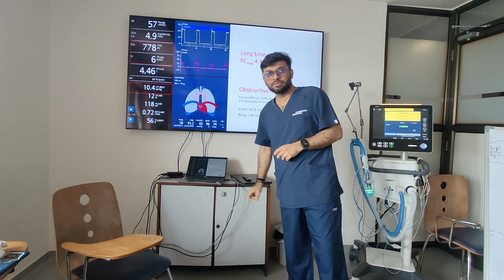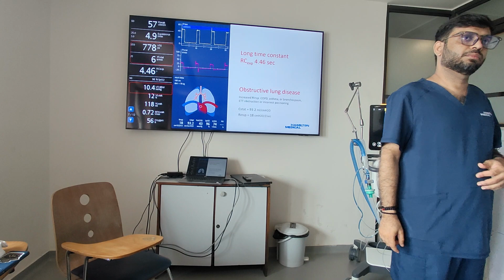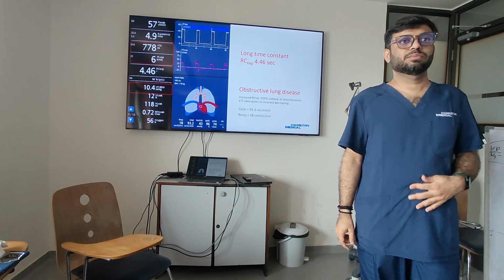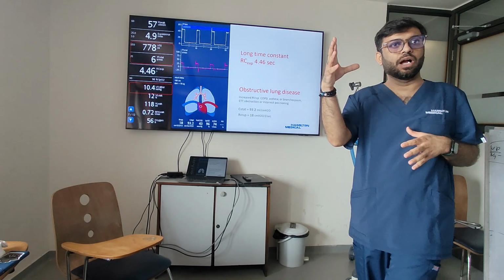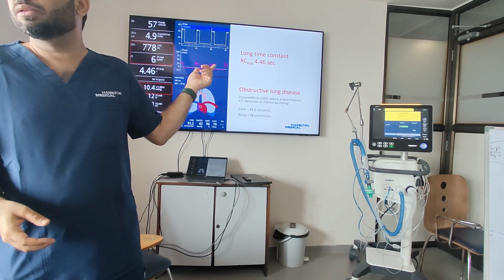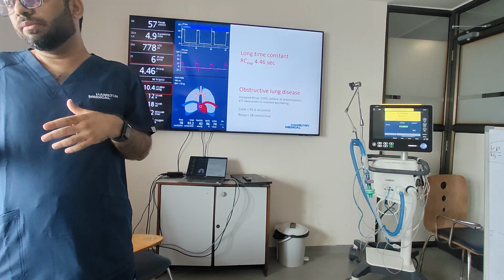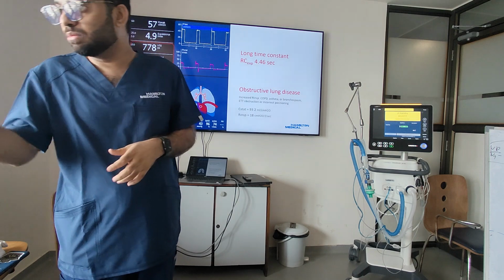So that set pressure is always the plateau pressure. That's what the PASV limit is all about. It's maintaining that limit. But you also said that for that patient yesterday, volume was very high. We may have to look at all the possible causes of the obstruction. At this moment it is maintaining the pressure. It's not increasing. We can see that. Pressure is down, even with spasm.